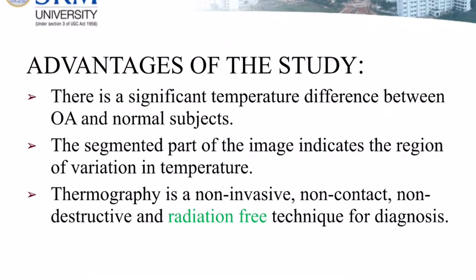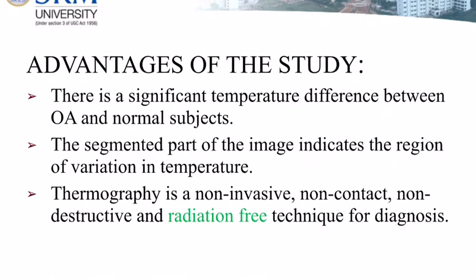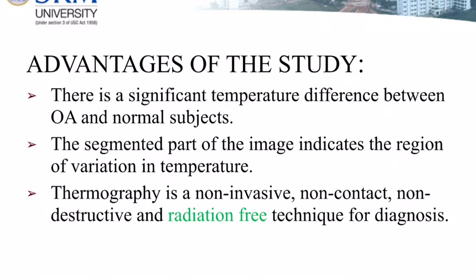The advantages of the study are that there is a significant temperature difference between osteoarthritic and normal subjects. The segmented part of the image indicates the region of variation in temperature.